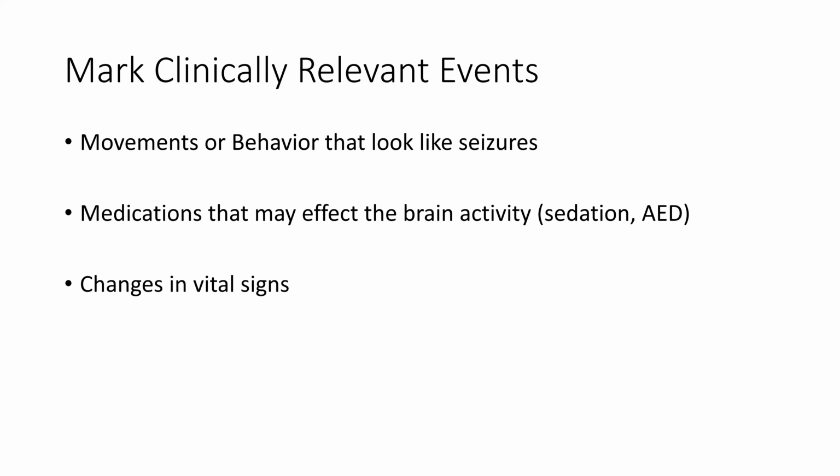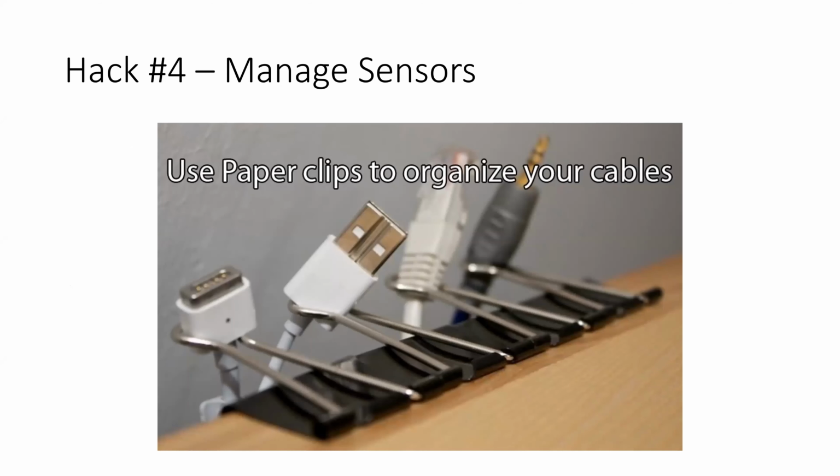And a lot of the devices have an ability to do this right on the screen quickly, so that it's not too time consuming, or to just use a pause or a press button that allows you to trigger seizures on, seizures off, meds given, those kinds of things. But they're really important to do. And ones that I don't think always get documented are things like I was mentioning, feeding, padding, and those cause huge amounts of artifacts.